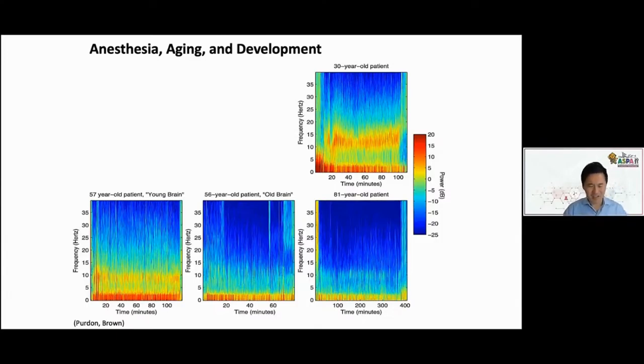If we had more time, I'd get into this. I think for the older adults, maybe I'll summarize by saying that the older adults who have a smaller alpha wave have lower anesthetic requirements. That has been discussed in a number of papers. One paper by Shao et al. from my group in Anesthesia and Analgesia in 2020. And then another paper from Gutierrez et al. from University of Chile. I'm happily a co-author on that paper as well, also in Anesthesia and Analgesia, talking about lower anesthetic requirements correlated with small alpha waves in older patients.